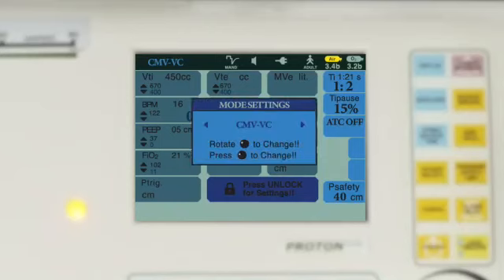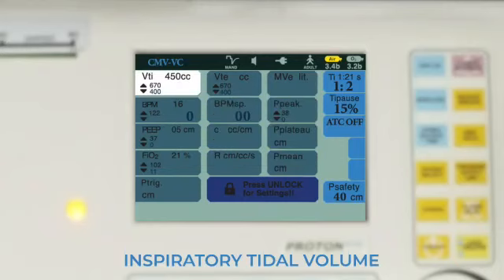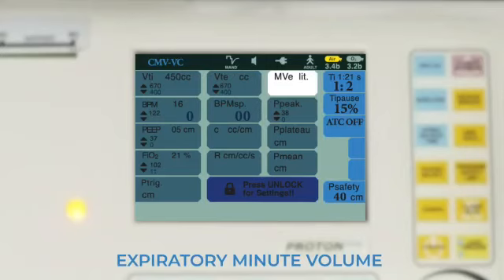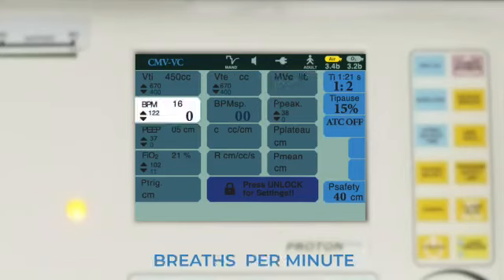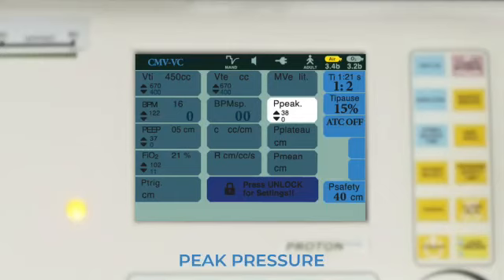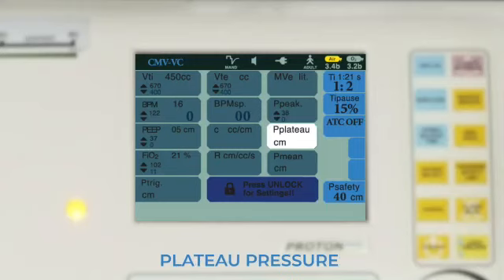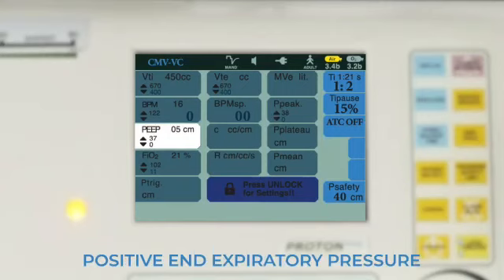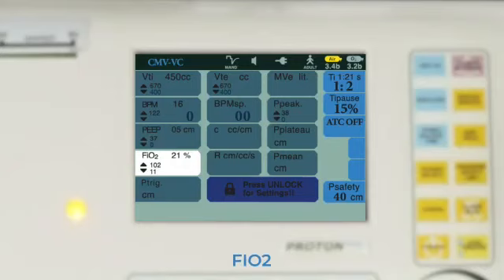Parameter setting: Once the mode is selected, it automatically asks for the respective parameters to be selected. As it is automatic, there is no chance of a miss out. For example, the mode selected is CMV VC. These are the parameters: VTI inspiratory tidal volume, VTE expiratory tidal volume, MVE expiratory minute volume, BPM breaths per minute, BPM SP spontaneous, BPM P peak, peak pressure, P plateau, plateau pressure, C compliance, R resistance, P positive end expiratory pressure, and FiO2.